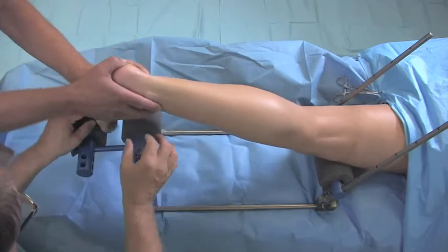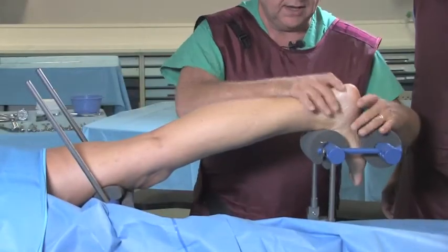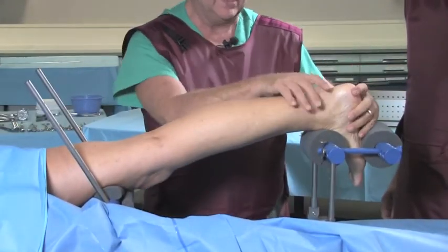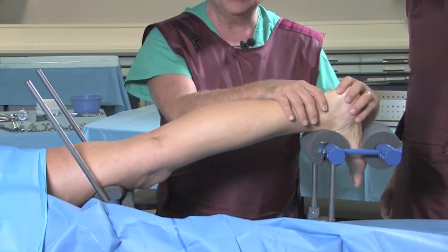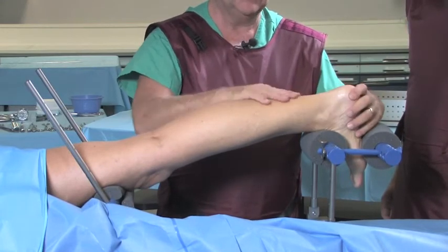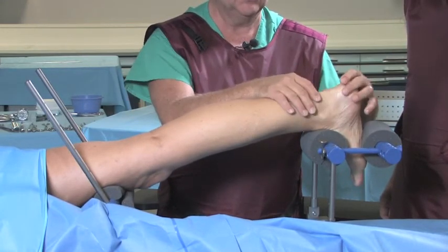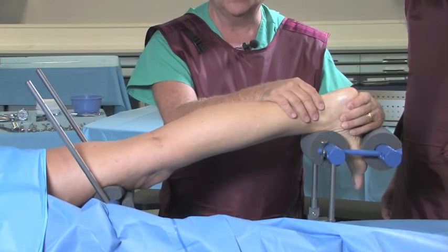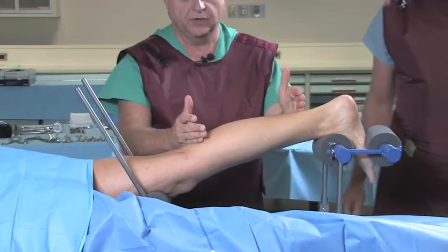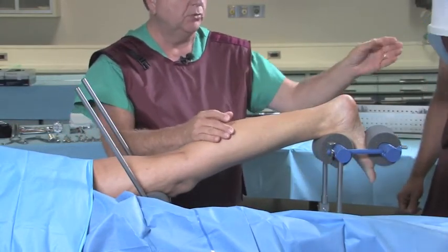We'll drop the foot back in place. And now we have access and visualization of this entire region, surgically and also with x-ray.